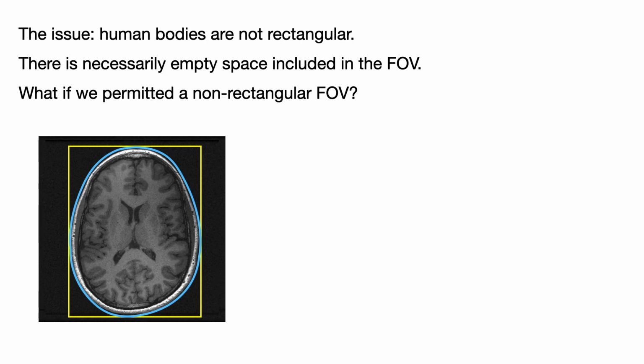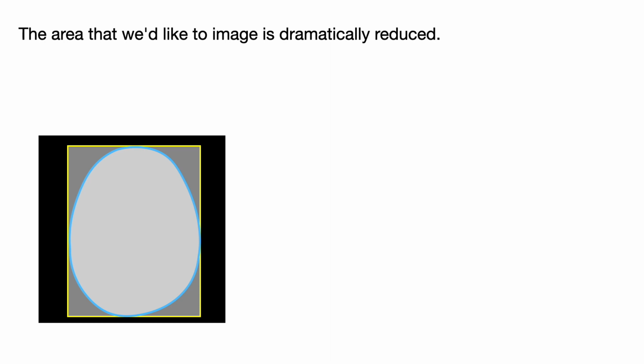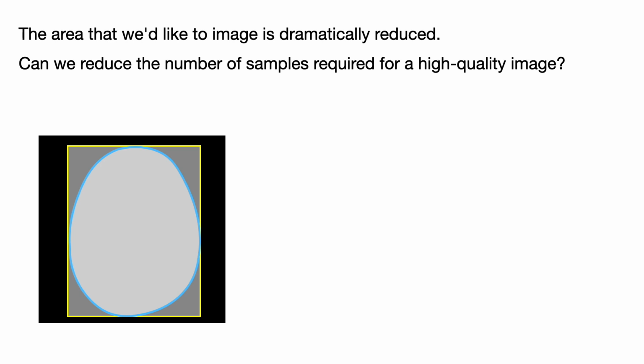But what if we permitted a non-rectangular field of view, like the blue contour shown here? The area that we'd like to image is dramatically reduced. Can we reduce the number of samples required for a high-quality image? The answer is yes, and that's what we'll be discussing today.